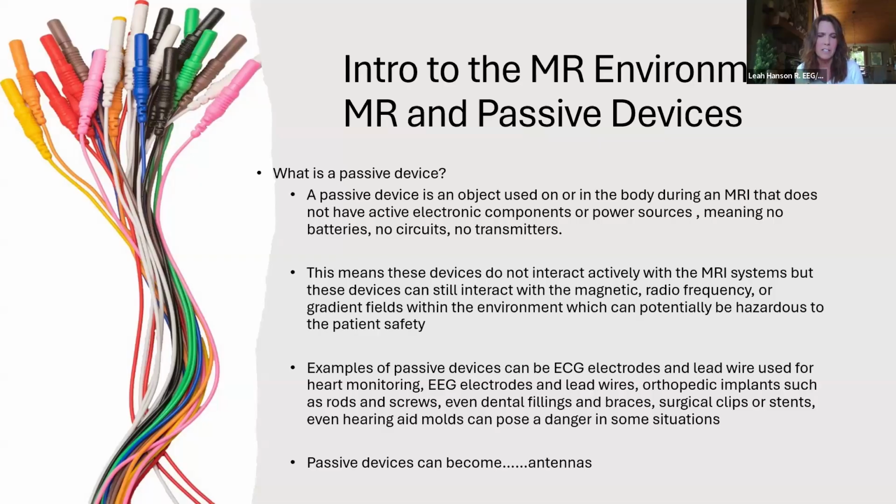And we know antennas in EEG very well because we know antennas as it relates to 60 hertz artifact in our environment. If you're an IOM clinician, technologist, you're in that environment, you know how to handle all that environmental noise. It's because our lead wires are antennas. So it's not a foreign concept for us to understand. Just absorb the fact that the takeaway is that this relates not only to artifact, but more importantly to heat.